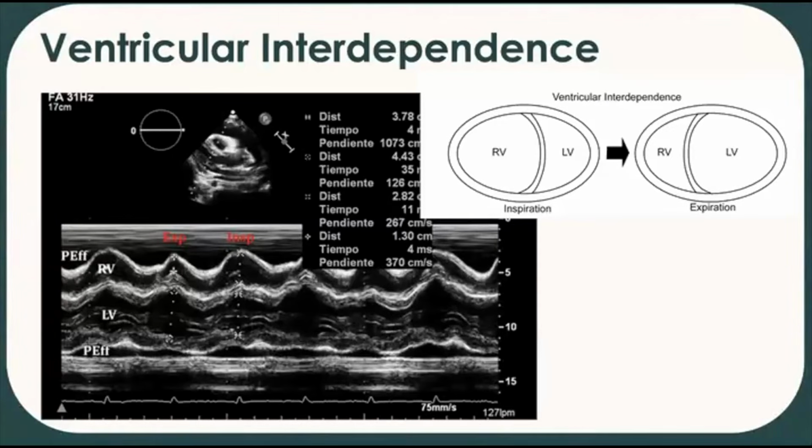And under normal circumstances, you do get a bit of the intraventricular septum shift, but the LV can still accommodate well. There's no hemodynamically significant change to your cardiac output. You can get a minimal physiologic drop in blood pressure with inspiration that's less than 10 millimeters of mercury of a change. And then the opposite happens with expiration, where your LV is able to expand, but as a result, your intraventricular septum shifts towards the RV itself. But again, it's all within normal range on a day-to-day basis. But I think the concept here is that filling of one chamber happens at the expense of the other.